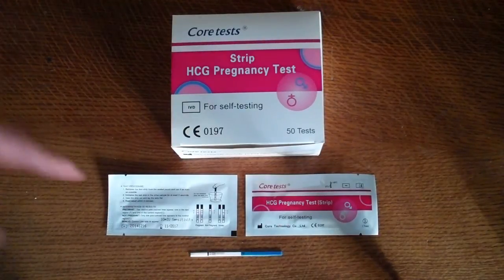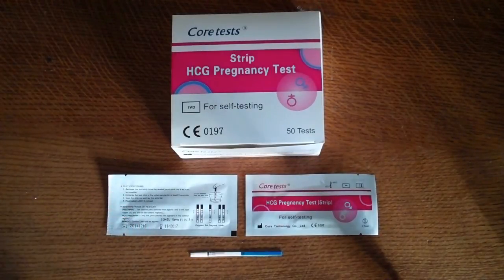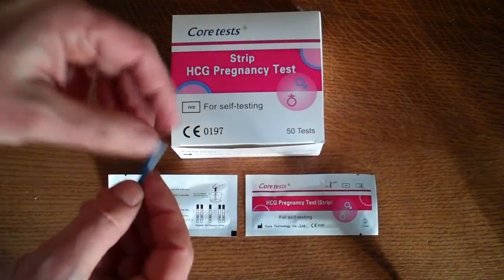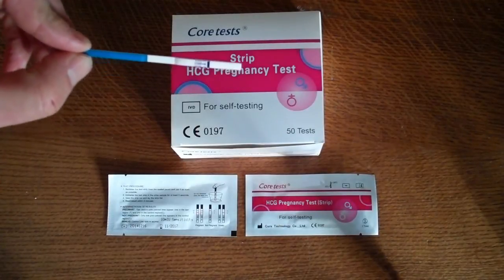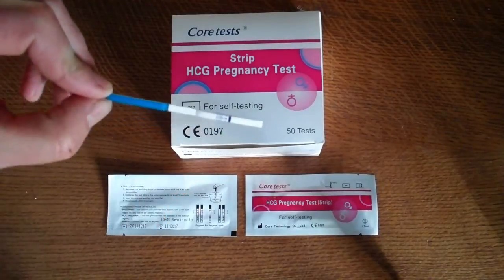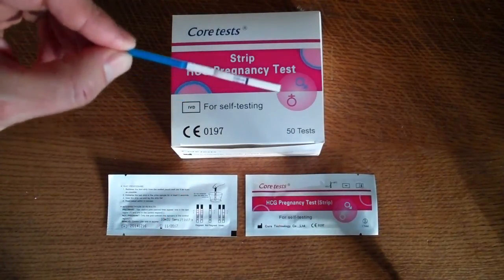The test foil is demonstrated here. Front foil tells you what it is. On the reverse there are simple testing instructions, so they're like a quick user's guide if you like. They do give examples of how to determine a positive and a negative test. And the foil strip, when it comes out of the packaging, is a standard blue handled dip test strip. You've got a dip end determined by the wavy lines and the maximum dip line, and you remove these from the foil just before you're ready to perform the test.